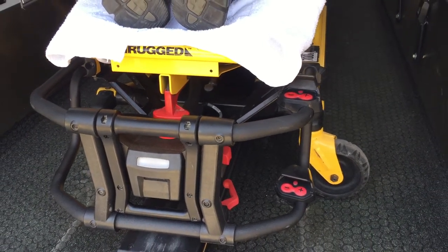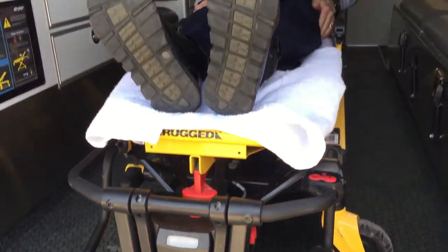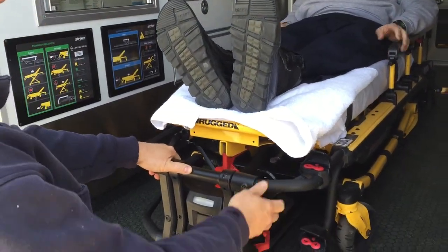This is a video explaining how the power load cot system works with the SMRT batteries. As you can see, we got a patient on our cot right now. Ricky's going to display how we're able to take the cot out very easily.